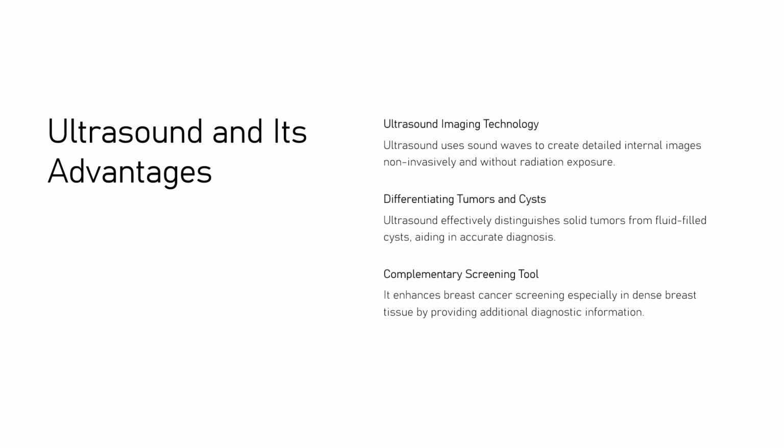Ultrasound uses sound waves to produce images and is effective in distinguishing solid tumors from cysts, especially in dense breast tissue. It adds value as a complementary screening tool.